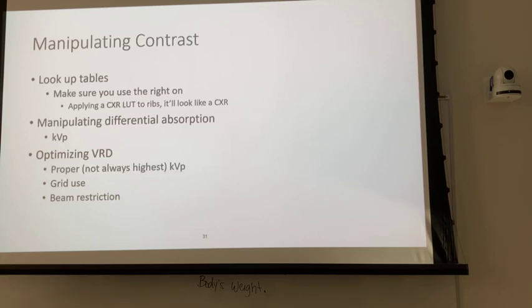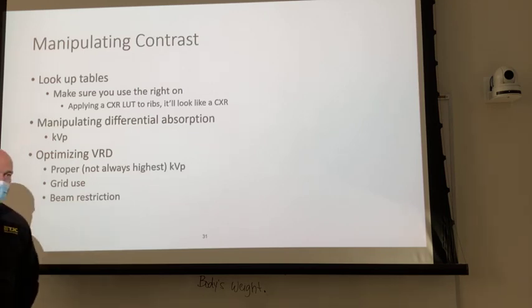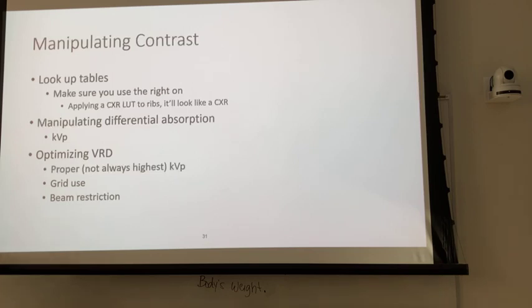So how do we manipulate contrast? We really don't. You can play with lookup tables, and you can hopefully maybe see some differences in contrast. Again, I say this, and it's not just lip service. If you play with your computer or your X-ray machine in clinicals, it might help some of this stuff to kind of gel a little bit.